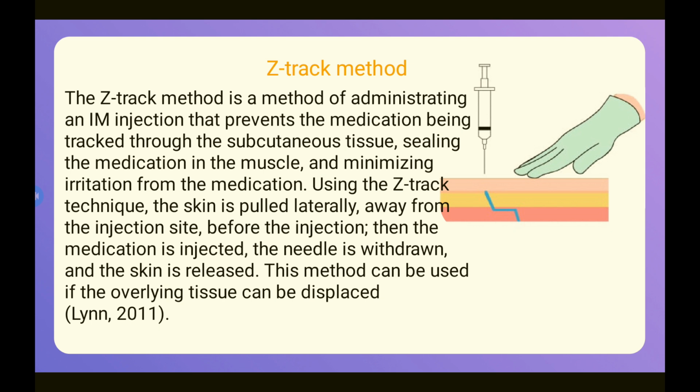Using the Z-track technique, the skin is pulled laterally away from the injection site before the injection. Then the medication is injected. The needle is withdrawn and the skin is released. This method can be used if the overlying tissue can be displaced.